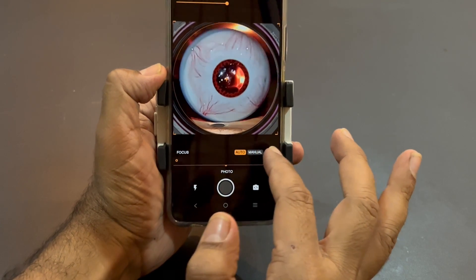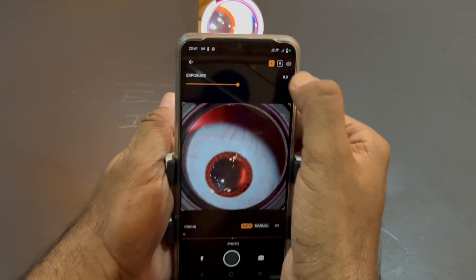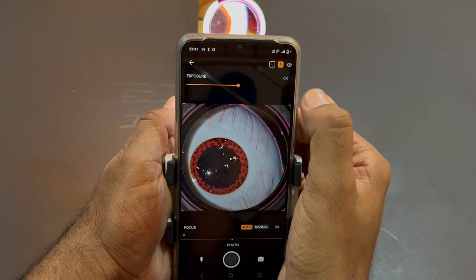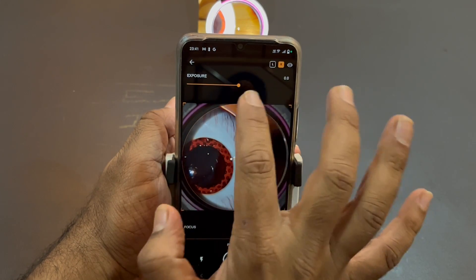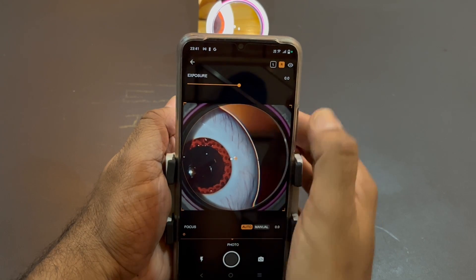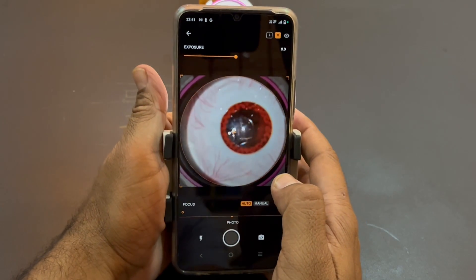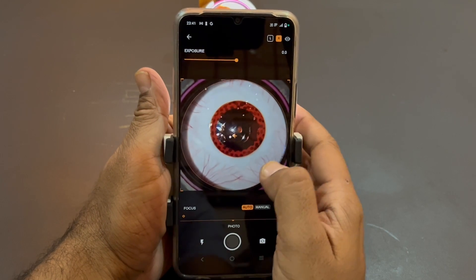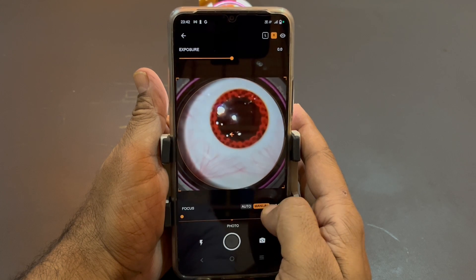Now I will explain R and L. At the top you will see R and L — whatever eye you are imaging, just click on the corresponding label, because it prints on the final report. For exposure, I suggest keeping it at zero, as it just controls the brightness of the screen. Regarding focus, most mobiles already have auto-focus enabled, but sometimes focusing may not happen automatically.